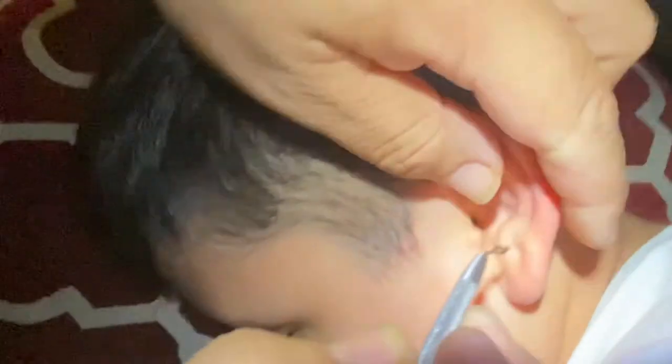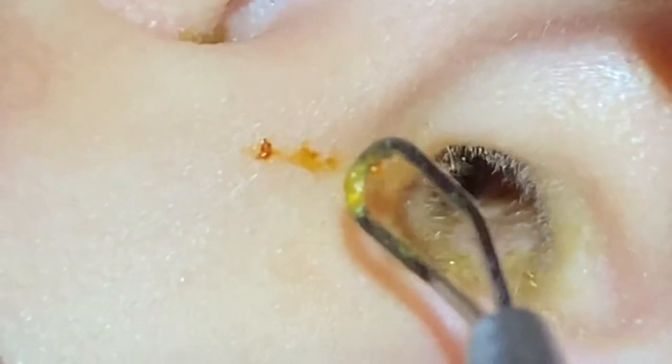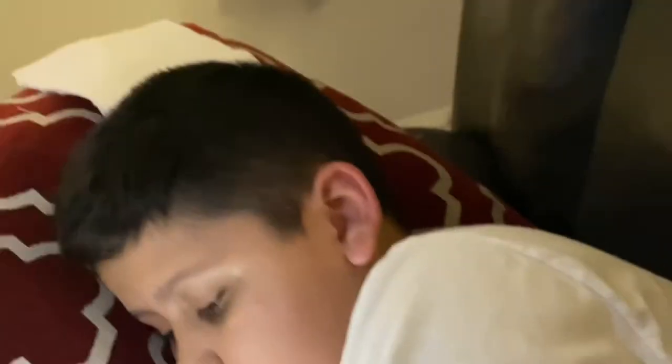That was weird. Kind of gross but yeah, it's there — look at that. Let's grab and scrape. Don't go too hard, you don't want to hurt anyone. Okay, let me see, I think it's clean. Let me zoom in hard — yeah, it is, it looks clean. Let me get this part. Let me see on the phone because I like that view right there. It seems it's all clean. Let's clean up with this and then we're done on this side.